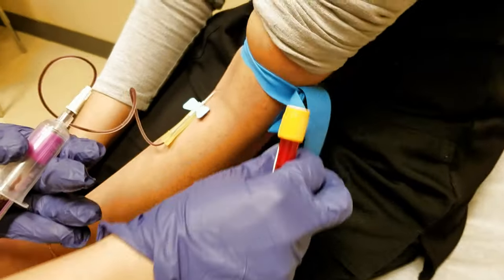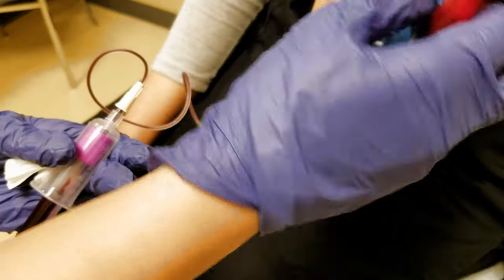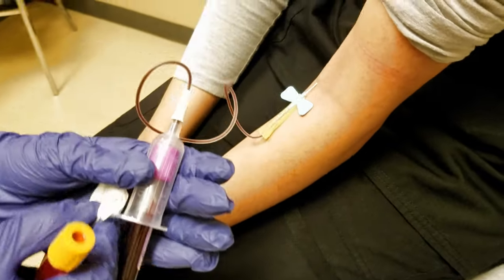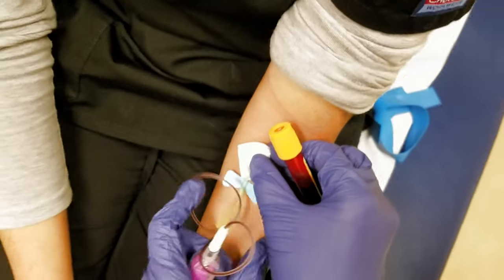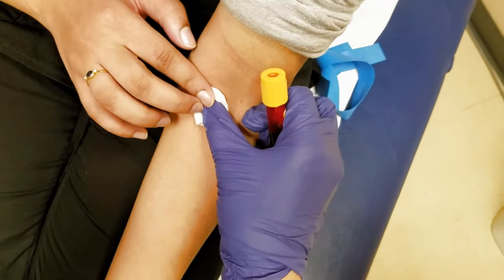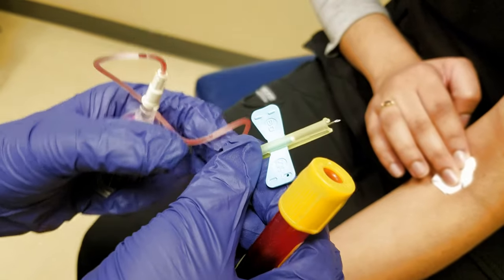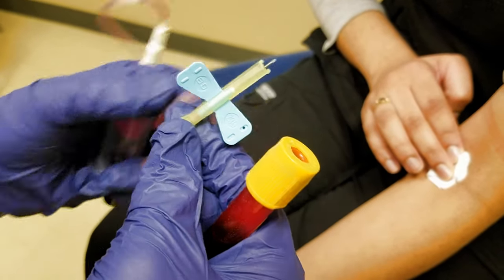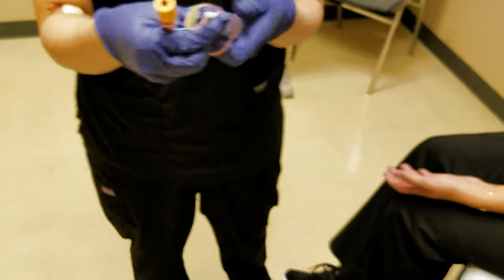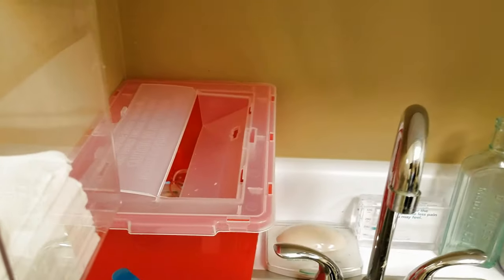Go ahead and undo the tourniquet. Then quickly take the gauze, put it over your needle, and then pull the needle out. Push down the gauze. Give a little pressure here. Your needle is going to be protected — there you go. Now to the sharps container. The whole thing goes in there.